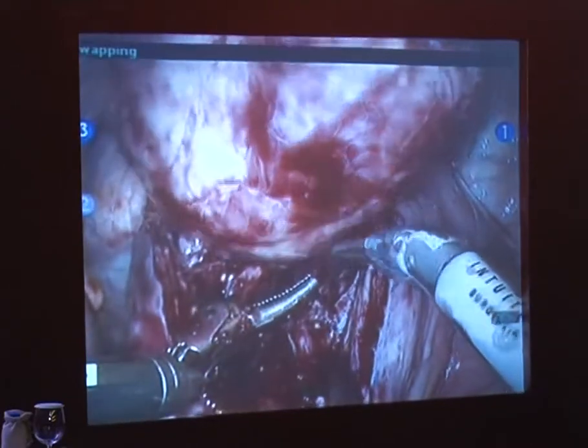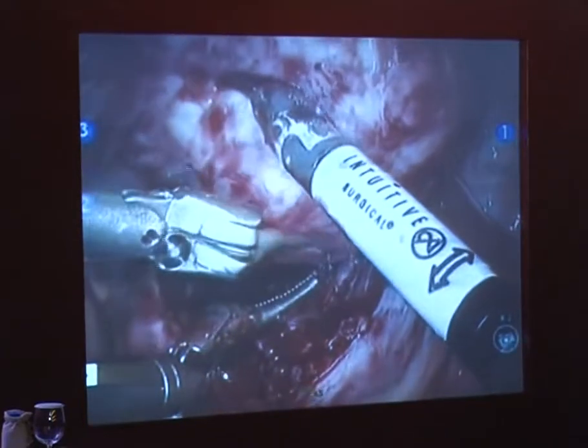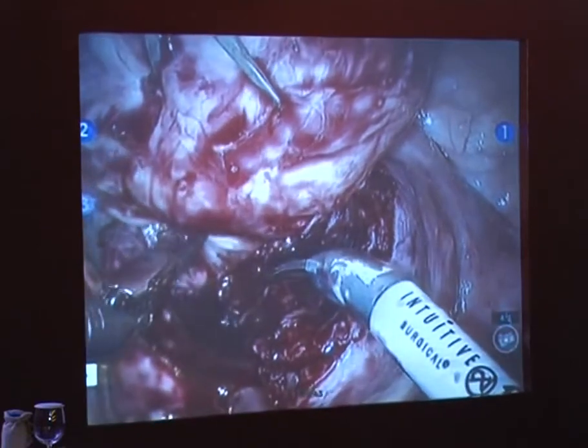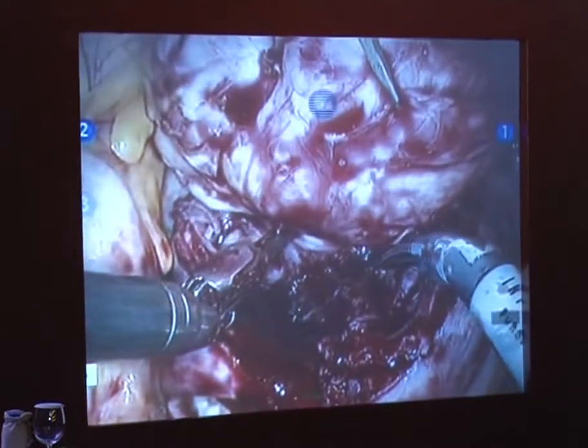We'll be taking that out. What I'm going to do now is, a lot of times, what helps is to actually take the myoma, and if you can lift the uterus up a little bit, we'll tuck it in the posterior cul-de-sac, and that'll actually help prop the uterus up.